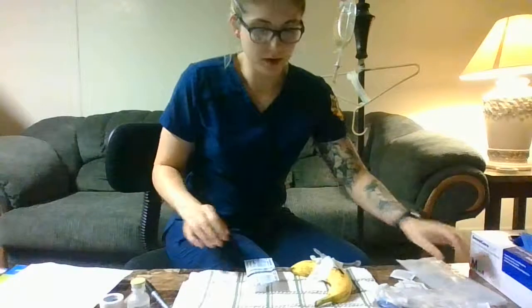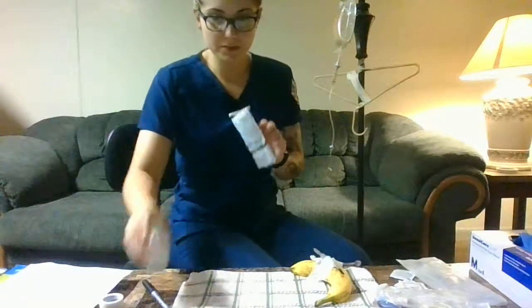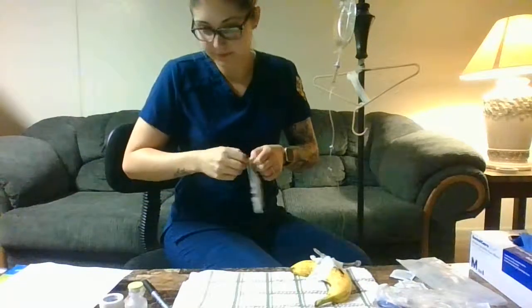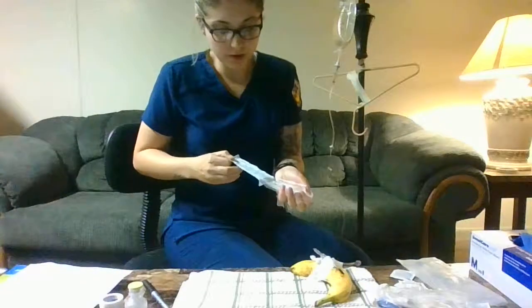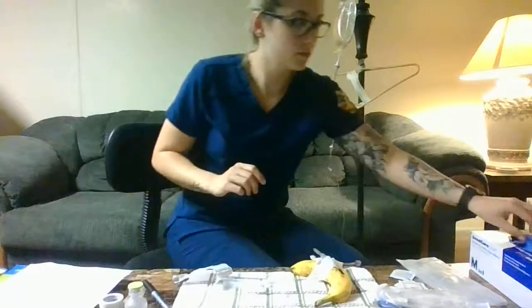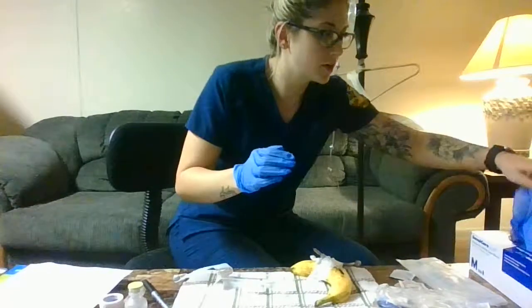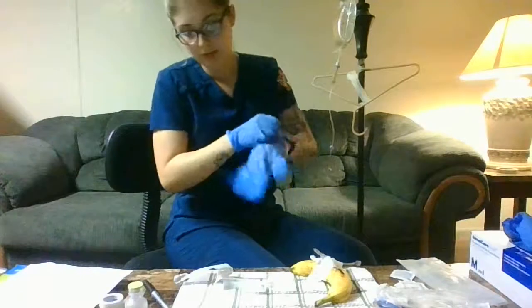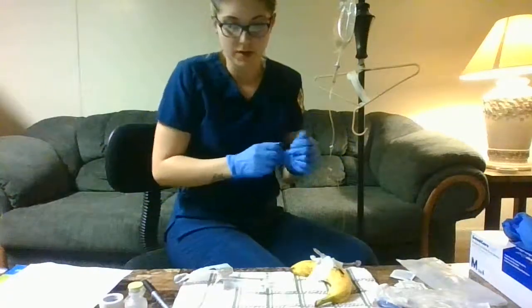We have our needle that we're going to use to draw out this medication. So we're going to draw up the 1.1 milliliters. And this is just a 22 gauge needle here.